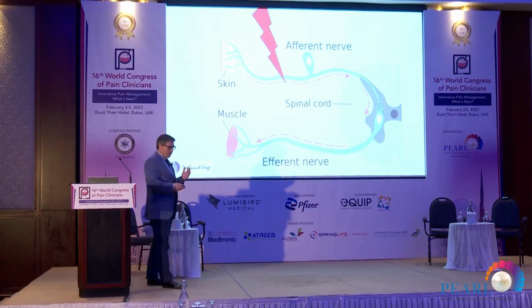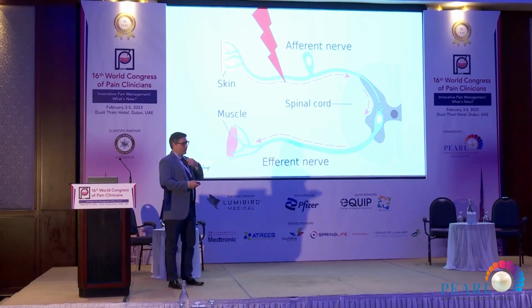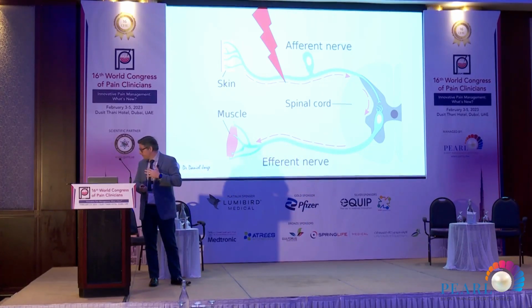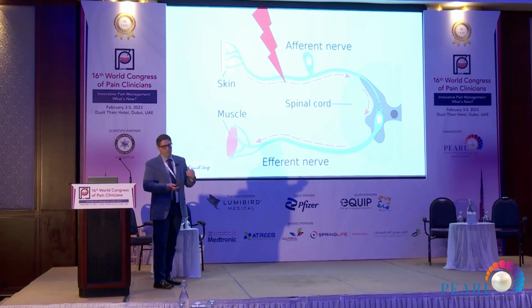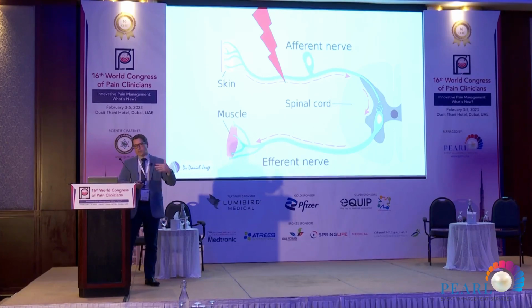Using this kind of procedure, you just want to block and inhibit the afferent nerve from bringing the pain from the skin or the joint into the spinal cord.